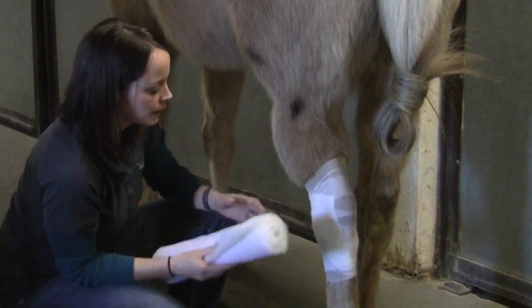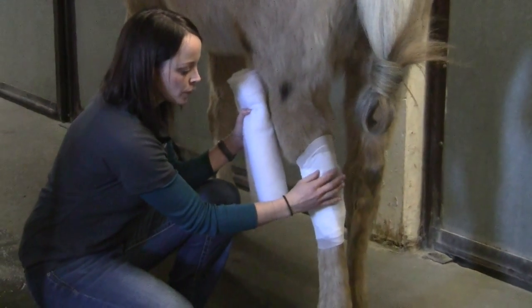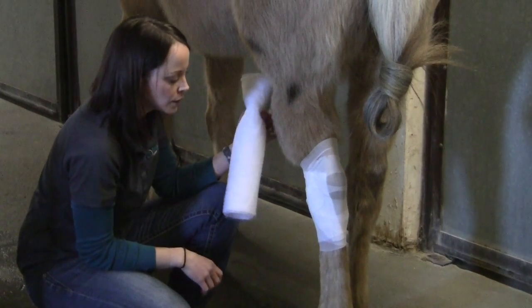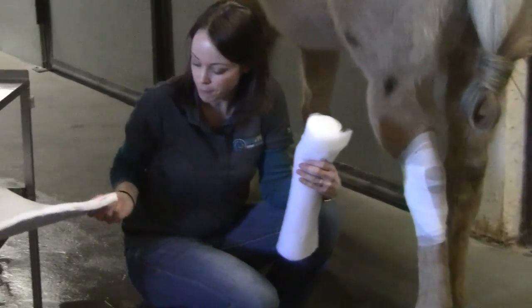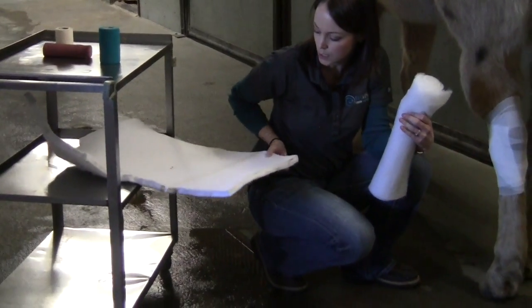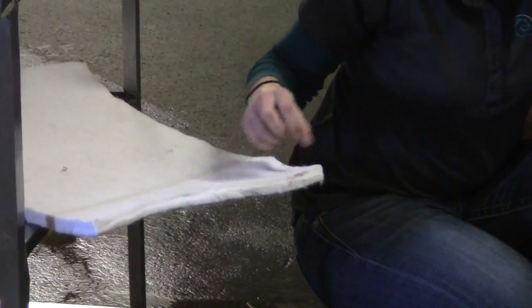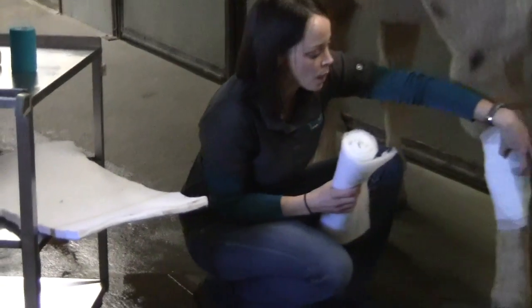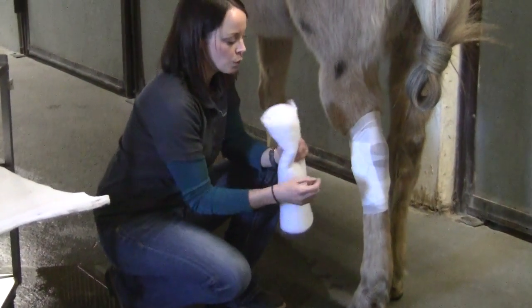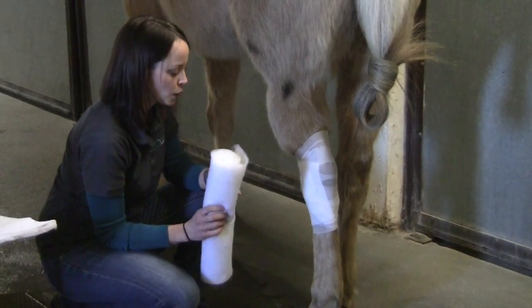Over top of this we'll put our cotton layer, and if you have started to get a pressure sore over the point of the hock we'll often use what we call a doughnut. A doughnut you can make out of some nice felt material — this is actually just an old saddle pad that we've cut up. You essentially just cut the shape of a doughnut with a hole in the middle that you can then place over the point of the hock to give it some pressure relief if needed. Usually you would put that layer on next and hold it in place with some white gauze before you put your pressure layer on.